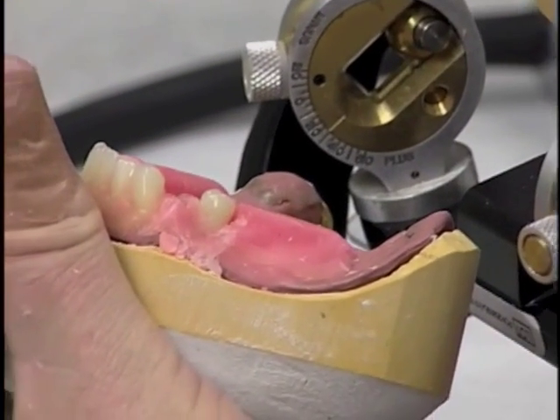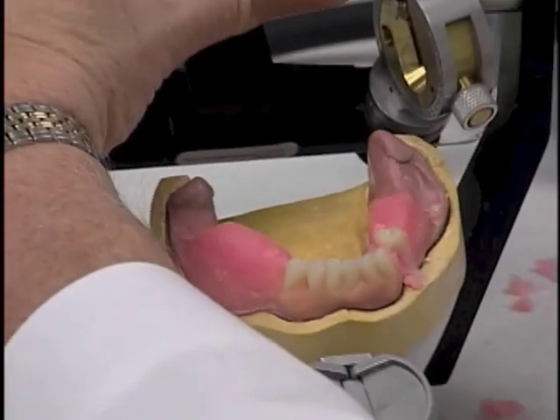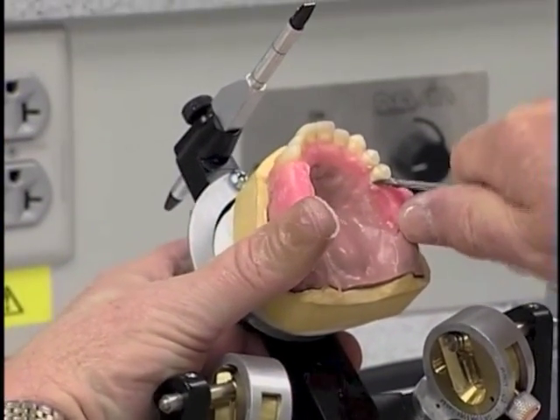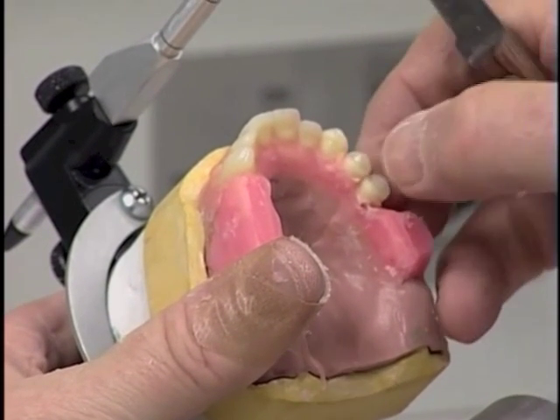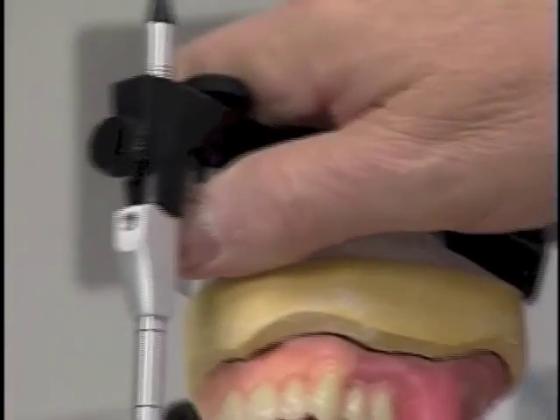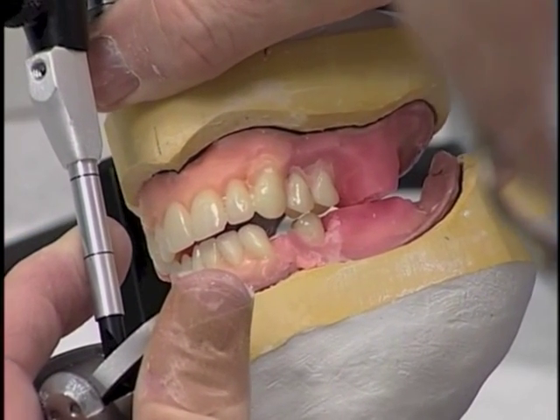So let's see what happens if we go to the maxillary now, and we're going to lower this buccal cusp of the maxillary just a little bit. Now it's much closer.